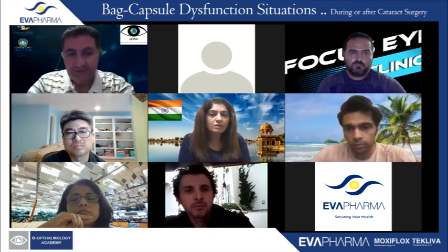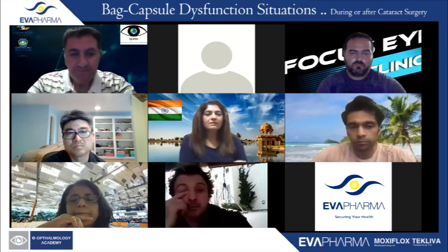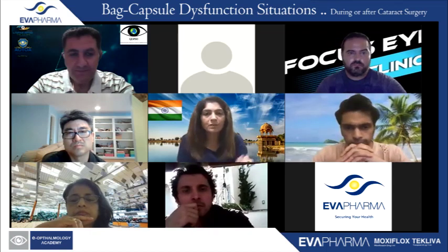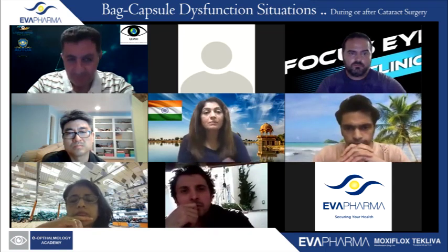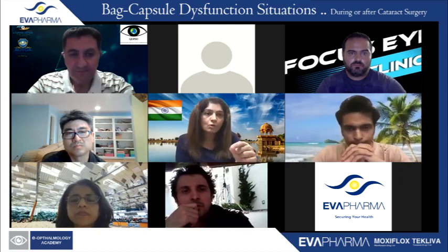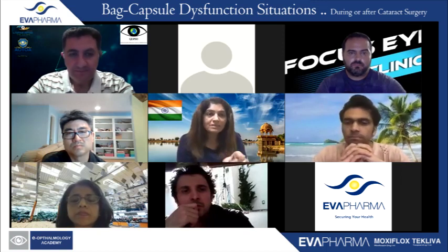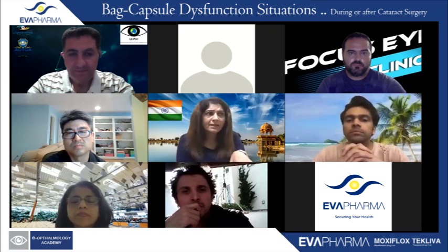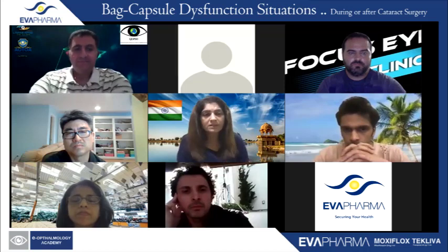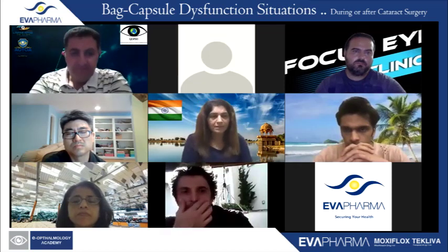It all depends. You might just remove those haptics and explant the intraocular lens, but maybe choose a different side. It depends upon the amount of fibrosis that you have. The haptic site is always open, but if you have a lot of fibrosis, you might like to create a different site with the new IOL. You can just go diagonally opposite and do that.